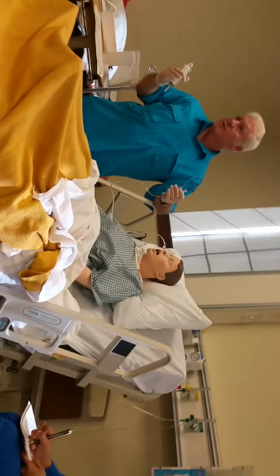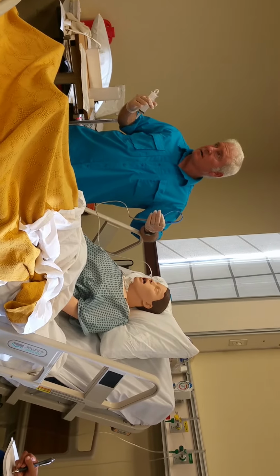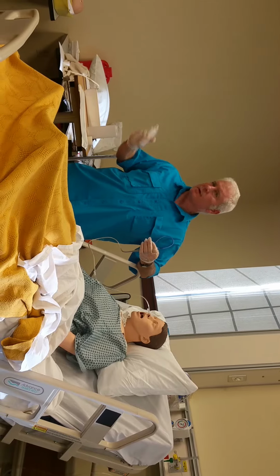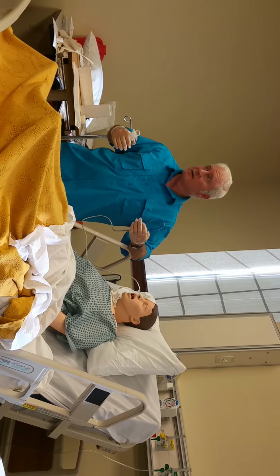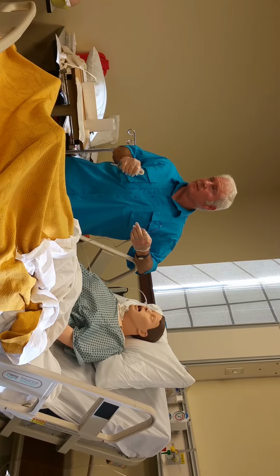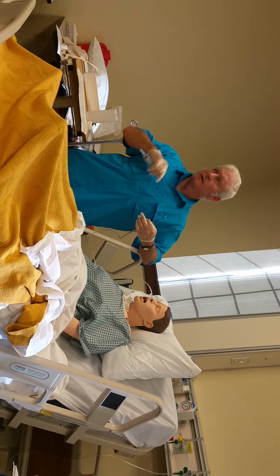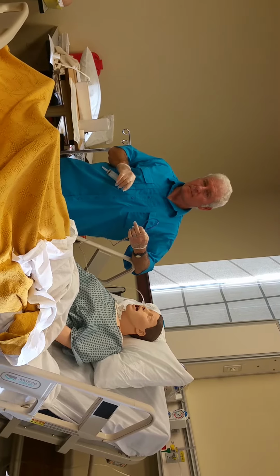But if we're putting 200 or 250 in there and he's got like 180, he's not digesting anything, right? So I think the book says if it's over 100, replace it and call the doctor. Don't do the feeding. Let the doctor know, because it's not being digested. It's not getting out of the stomach into the small intestine, okay? But double check me on the book, I'll double check it too. But I think the book says 100 or less, replace it, continue with the feeding. If it's over 100, replace it, hold the feeding, okay?